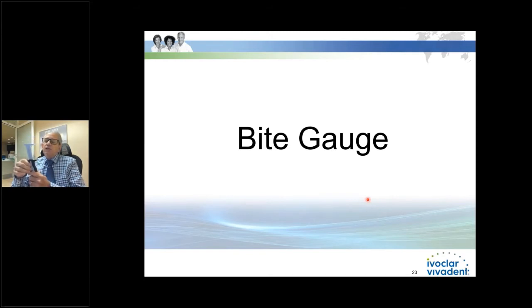Another technique that I really like to do with this is I can also turn this around. I really like this technique. And then we can look and we get the same numbers. So either way we do this, we get the same numbers. And then you could maybe do the tongue depressor and do everything. The calipers are nice, but I could do without it. If you didn't want to buy the whole kit, then you don't need the calipers.